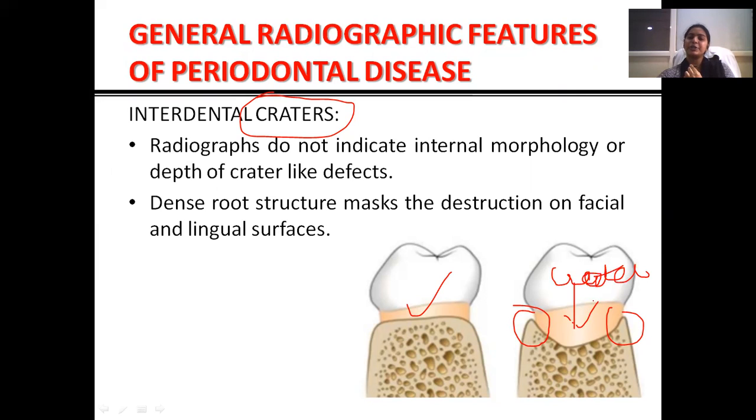Do you think we can appreciate this on radiographs? No, we cannot appreciate it, because the intact facial and lingual plates are masking the defect in between. So we cannot appreciate craters on the radiographs.